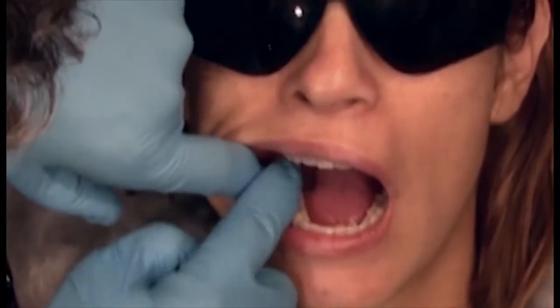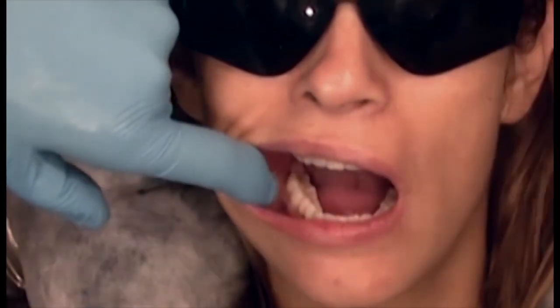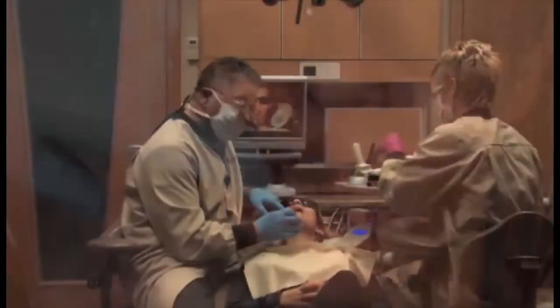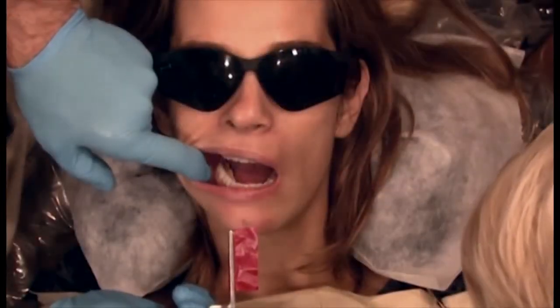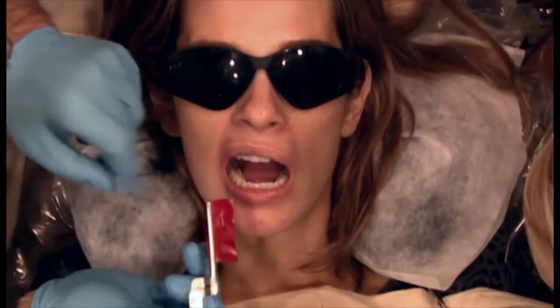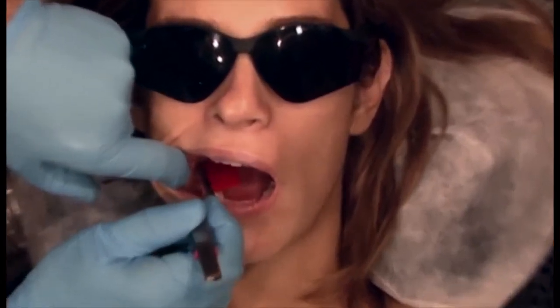Let's check to see if we can verify what tooth that is. We'll dry it. And what I'm going to use is the thin articulating paper. We'll use the red one, and see if it actually is touching on the right side. And this red paper, we've put Vaseline on the paper so it's ink, so the ink will work much better when we try to mark the teeth.